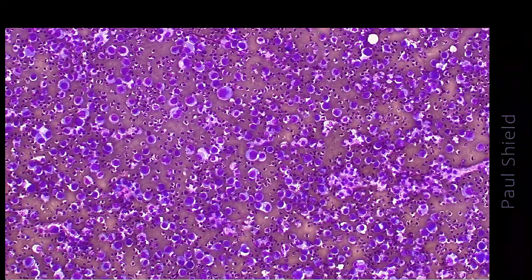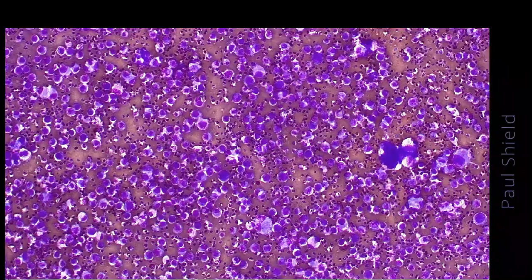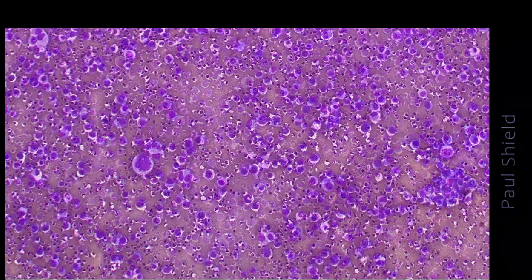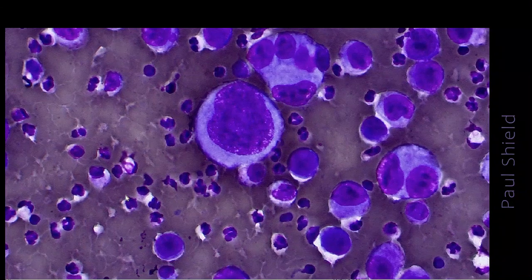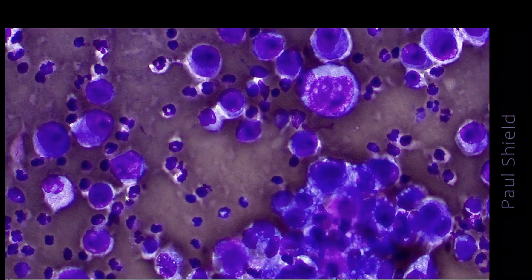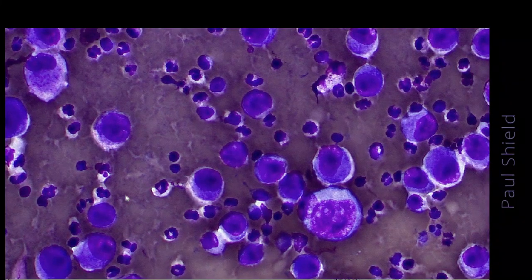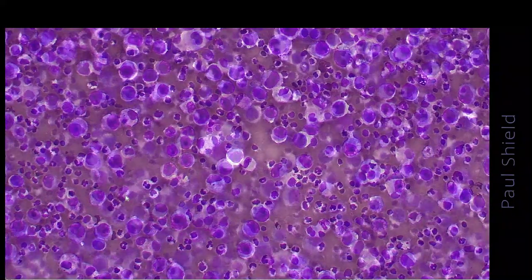Finally, here's another case, quite bloody, very dispersed looking cells. Can't see too many groups at all. Possibly one here. And quite a large cell there, so that's quite suspicious as well. On high power it's got possibly 2 nuclei, but very large nuclei with coarse appearing chromatin, very prominent nucleoli. It's a little hard to evaluate whether these are mesothelial or not, but I'm thinking that they're probably not.